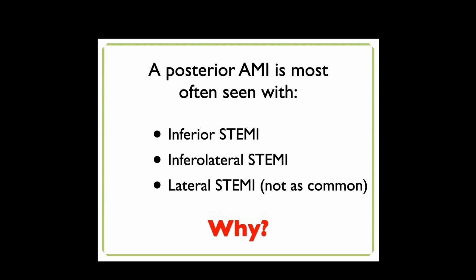Really the same answer as the right-sided. Why do we see, what does it say again? Same artery. Yeah, and in this case, again, remember the inferior STEMIs and the inferior laterals. The inferior laterals are probably left circumflex. This one could be either RCA or LCX.